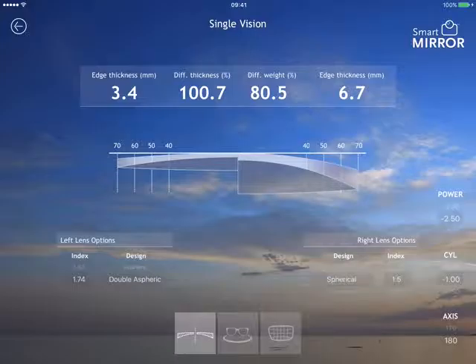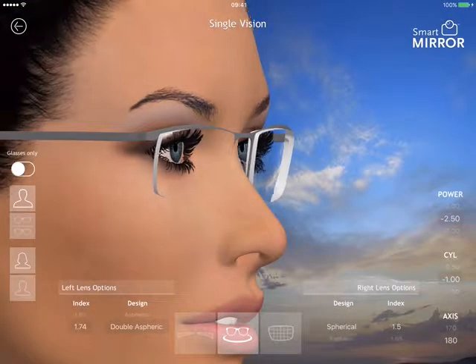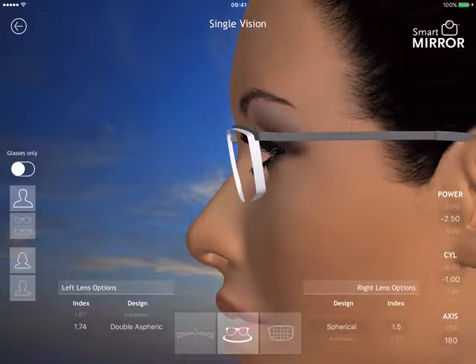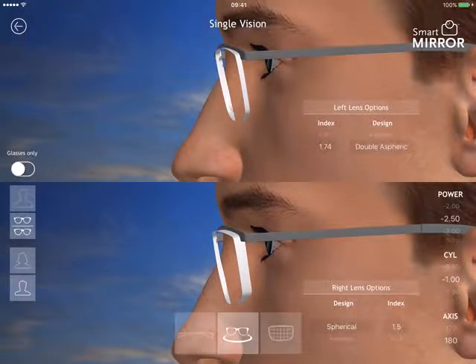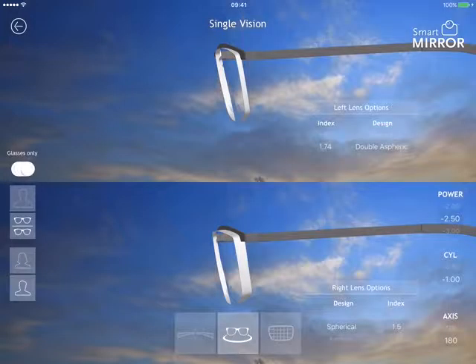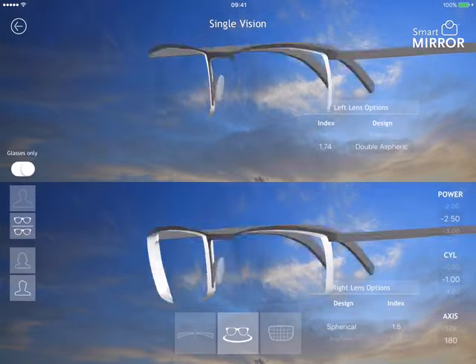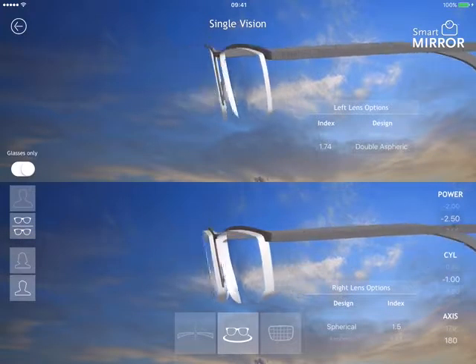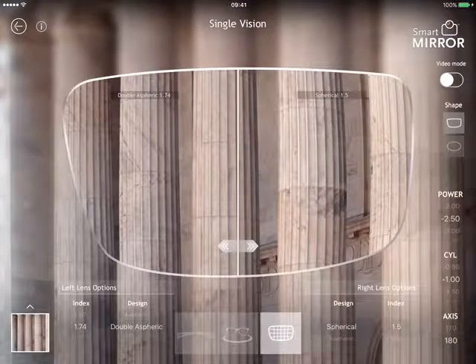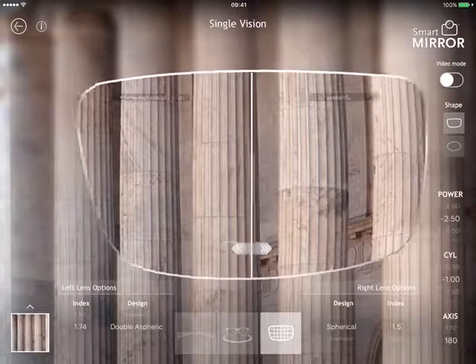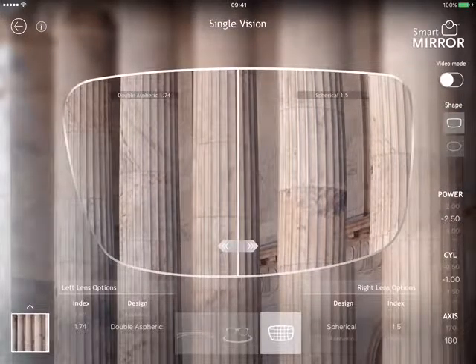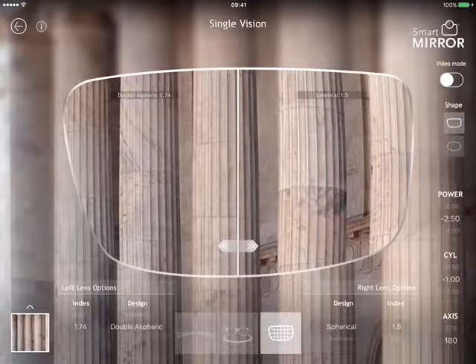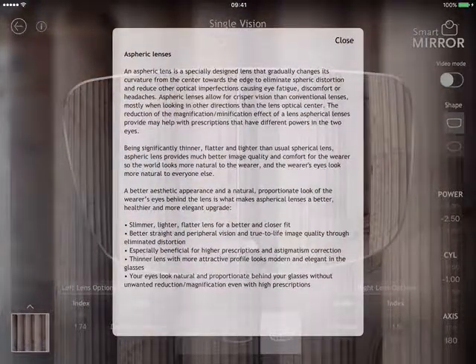So this is the edge thickness — the 1.74 being 3.4mm and the 1.5 being 6.7mm — showing the difference in thickness and weight. You can also run this in 3D mode: the 1.74 double aspheric versus the 1.5 spherical, with male and female options and tile mode where you can show just the glasses. You can also show the distortion between the double aspheric 1.74 and the spherical 1.5. Again, for this you have an info section.